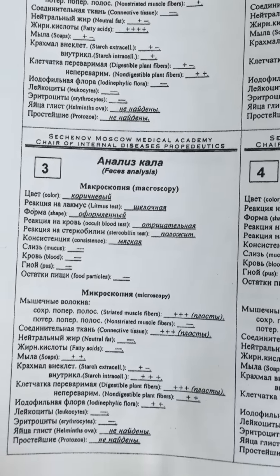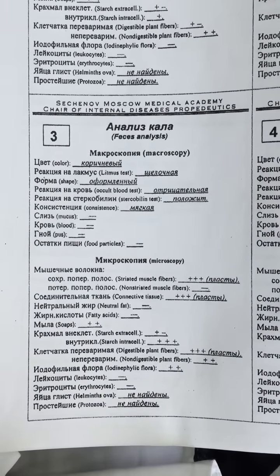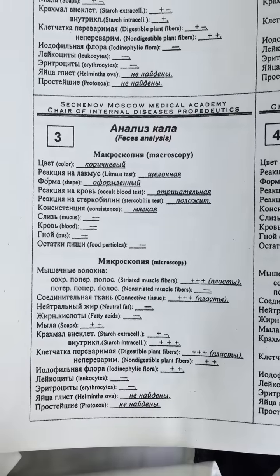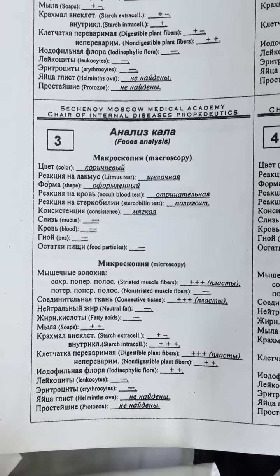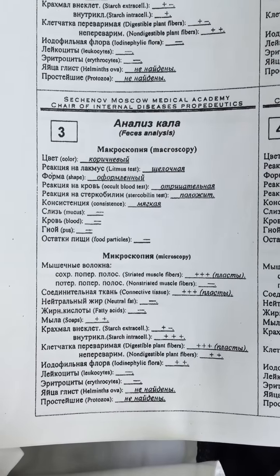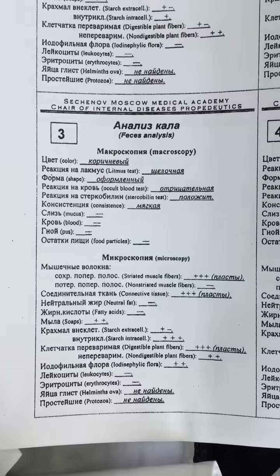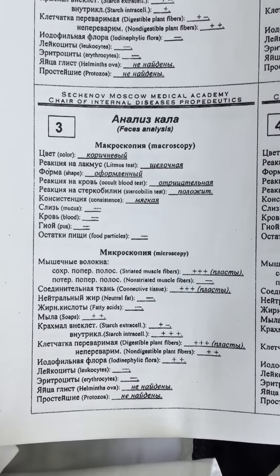Number 3, the color is brown, the reaction alkaline, the shape is normal, occult blood test negative, stercobilin test positive, consistence soft, yes, mucus absent, blood absent, pus absent, food particles also absent.